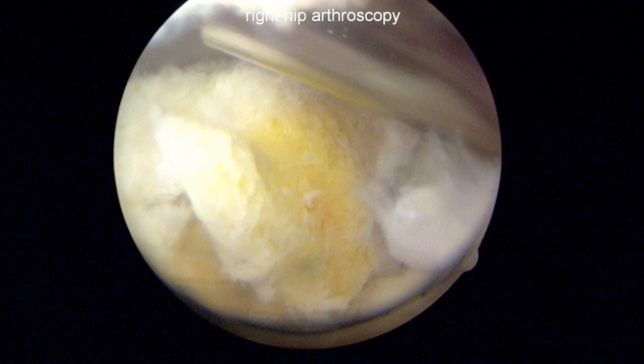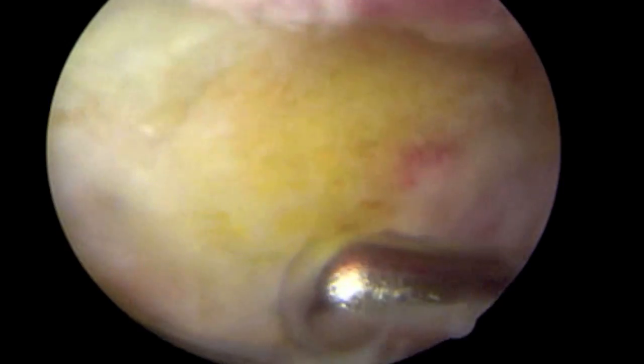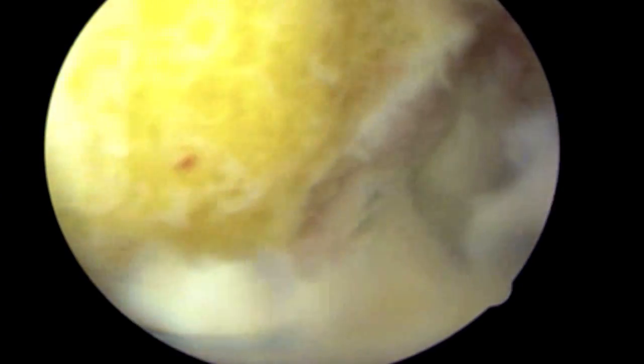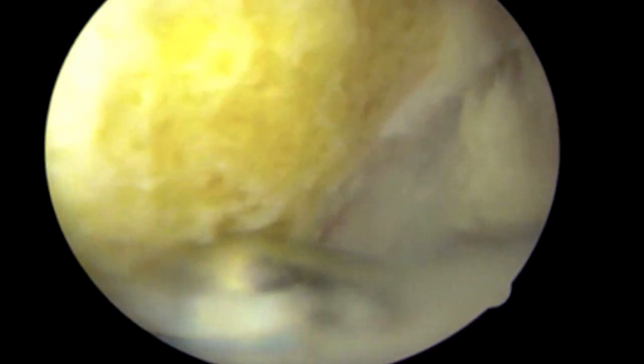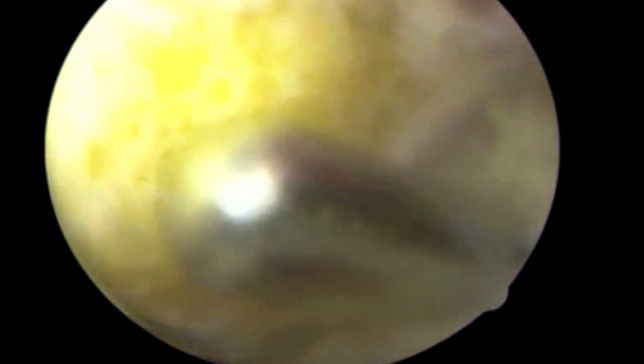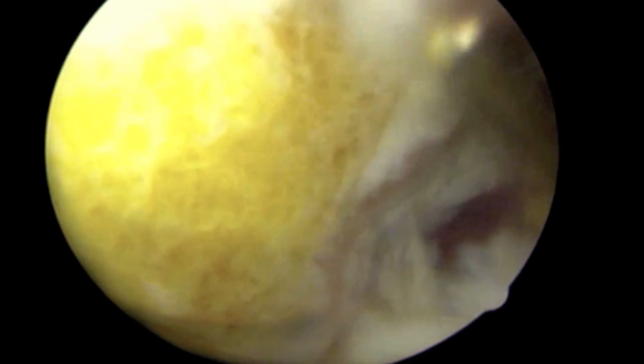This is a hip arthroscopy video for the treatment of os acetabuli. The acetabulum is the cup of the socket in the hip joint itself. In this case, there is an unfused area of bone which has not normally become one single bone in the cup of the socket. This video demonstrates freeing up of this fragment prior to performing a labral reconstruction and a rim trimming, as it contributes to femoral acetabular impingement and hip pain in a young adult male.